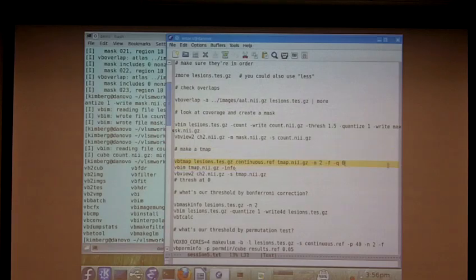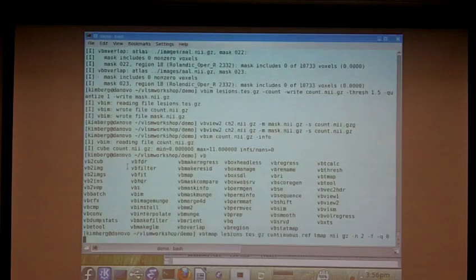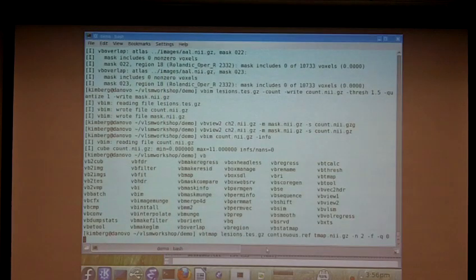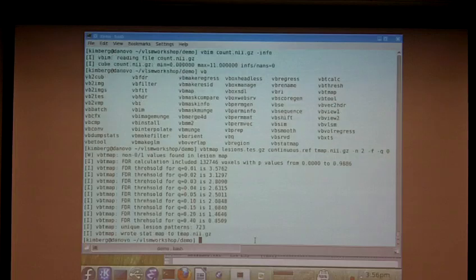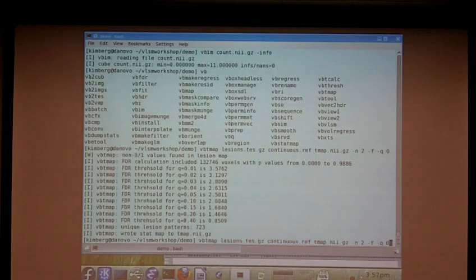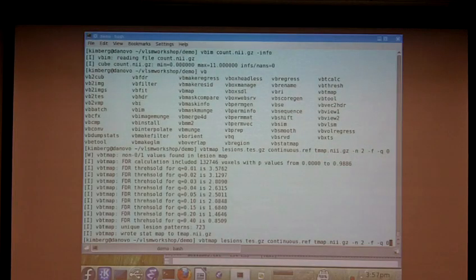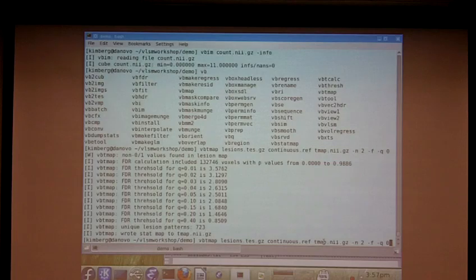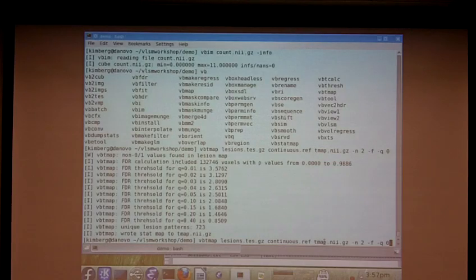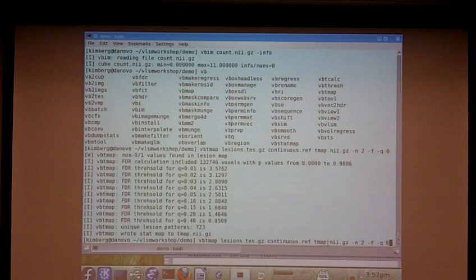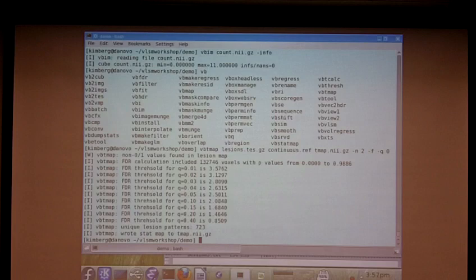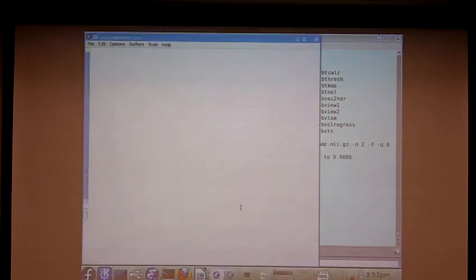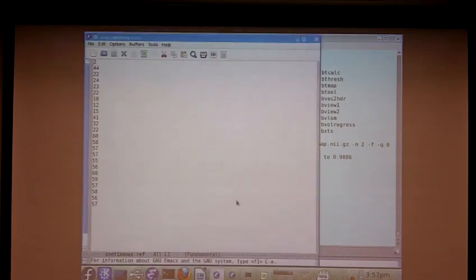So here's the VBT map command. Let me just grab the whole thing and put it in our shell. So it takes three sort of mandatory arguments. One is the name of the lesion file, one is your dependent measure, and one is the name of the file you'd like to create, which in this case we're calling T map. Can you talk a little bit about the format of the dependent measure? Oh yeah.